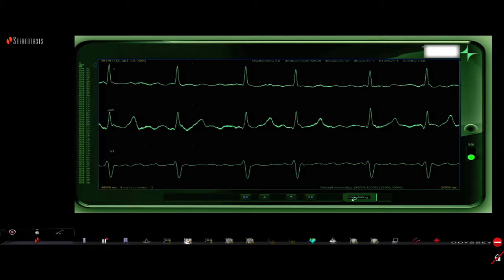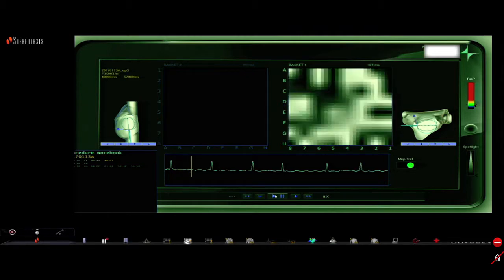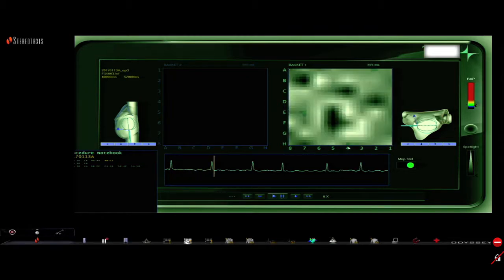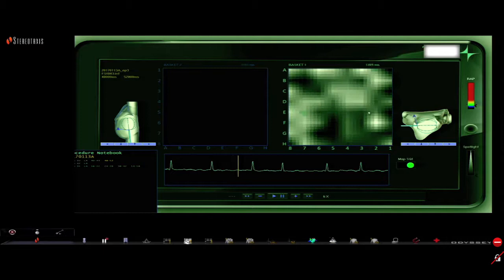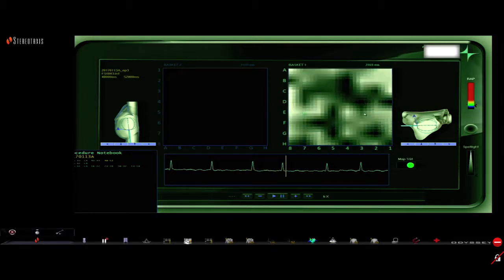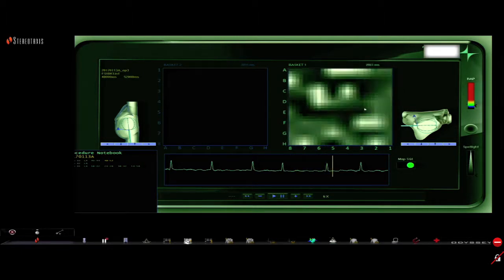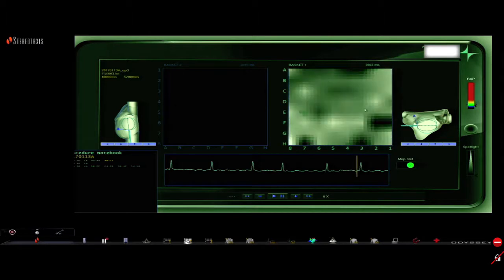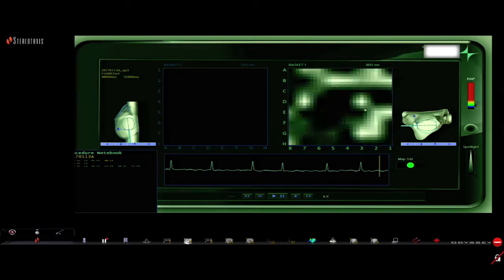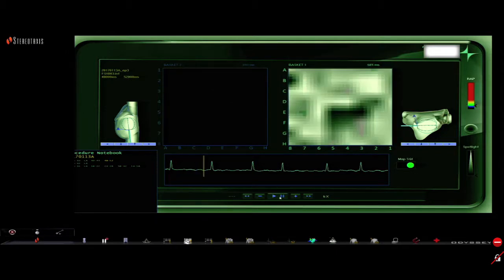Another 4-second segment of that was taken. And this is the area we're looking at again, and you don't see it quite as strongly in this second, on this particular 4-second epoch. So we're going to look at one more.